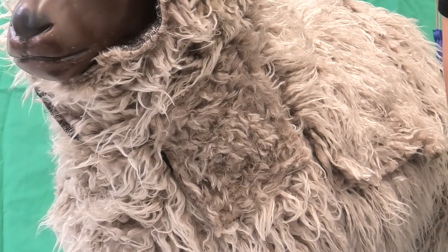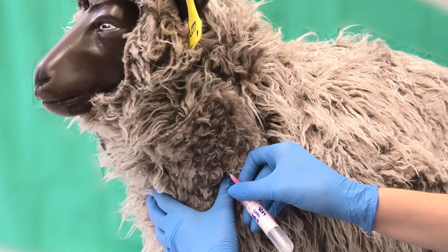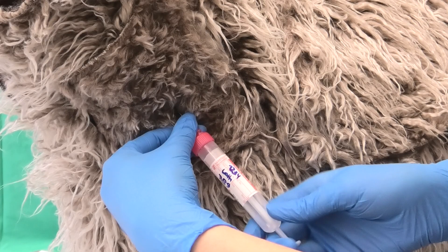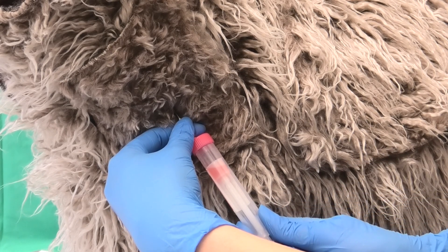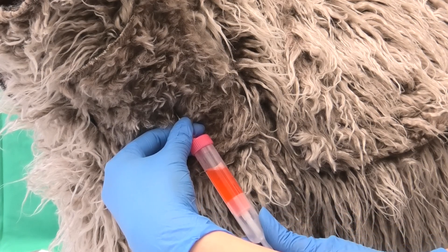On a living animal, it is recommended to count down to the puncture, allowing the restraining person to anticipate sudden reactions. The cannula is quickly inserted at an angle of 30 to 40 degrees to the skin. The cannula hub is held between thumb and middle finger while the index finger remains in contact with the animal and instrument. The congesting hand can now reach over, aspirating the monovet, which creates a suction force causing blood to flow into the monovet.